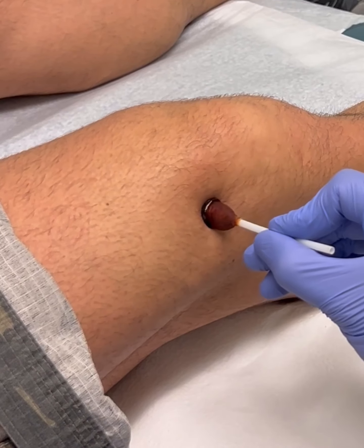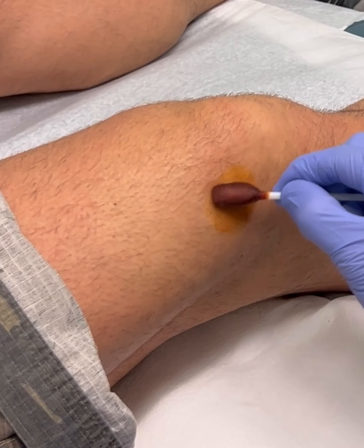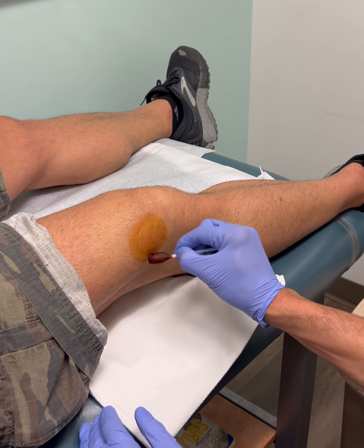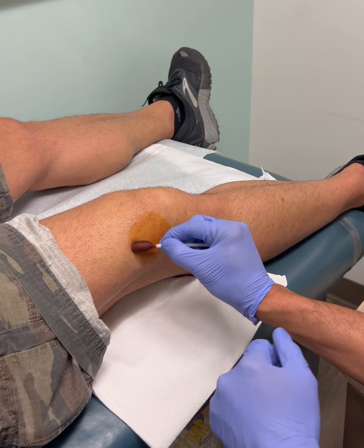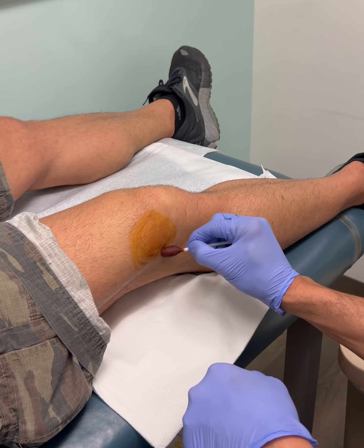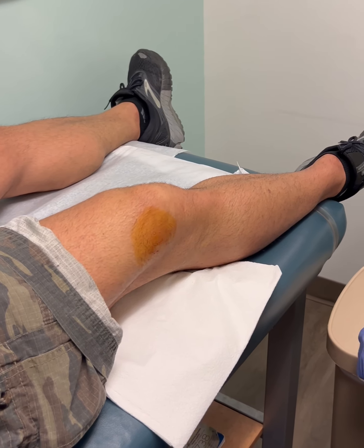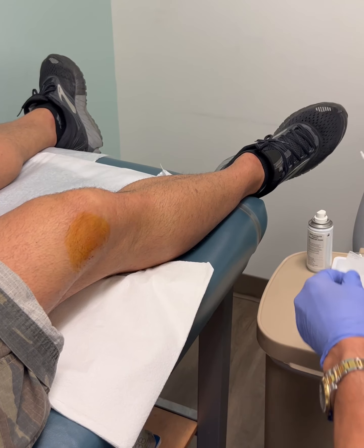I make an indentation — see that indentation? That's my target. I go outward with the betadine swab and I'm not going to touch the center again except with the sterile needle in just a second. That's what we do with that. The next step is we're just going to numb the skin right there.